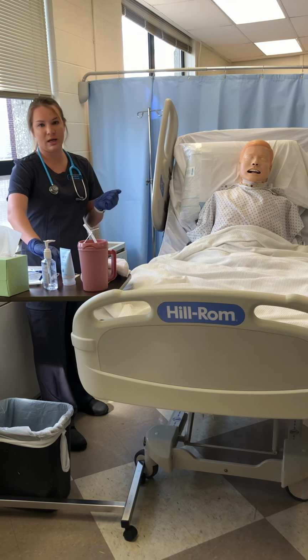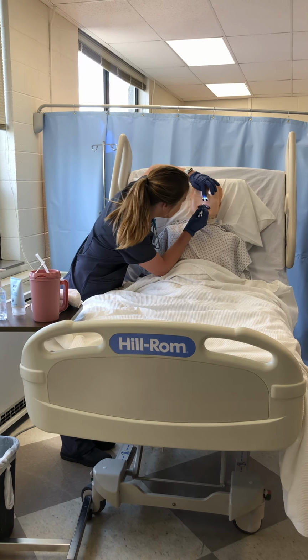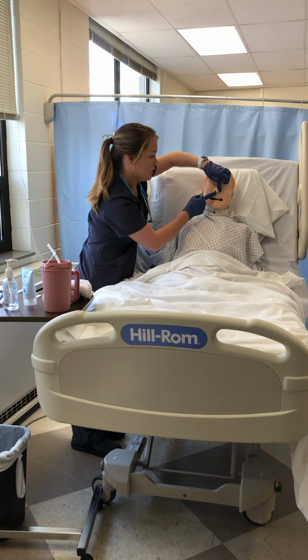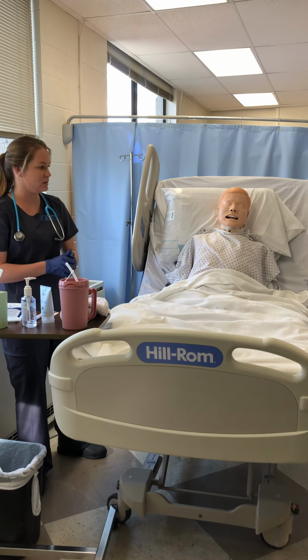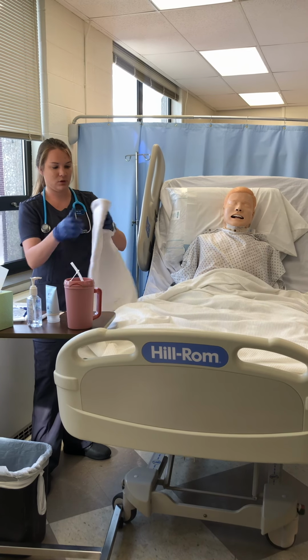I already looked to see if he had any recent nasal surgeries. Going to look in his nose, see if he has any abnormalities or symptoms. Assess his ability to breathe out of each nostril. I'm going to assess his gag reflex and his mental status to see if he's going to cooperate with us today, which he is. So let's get a few things set up.